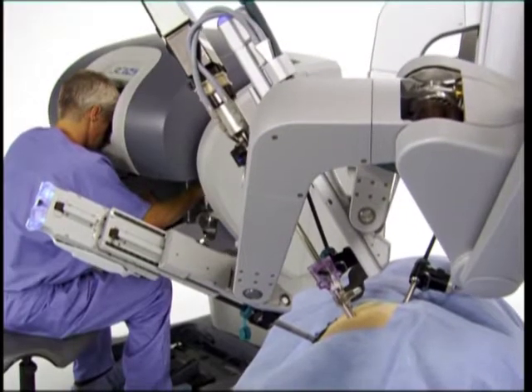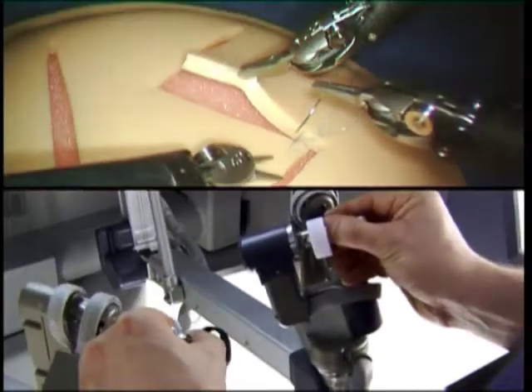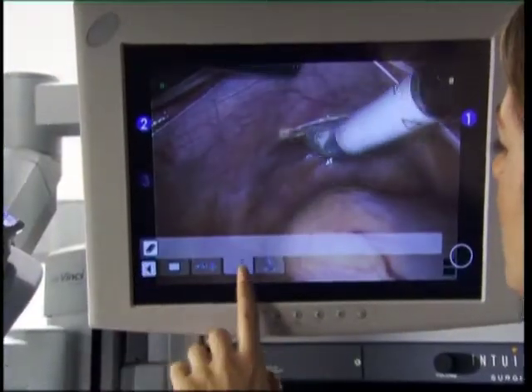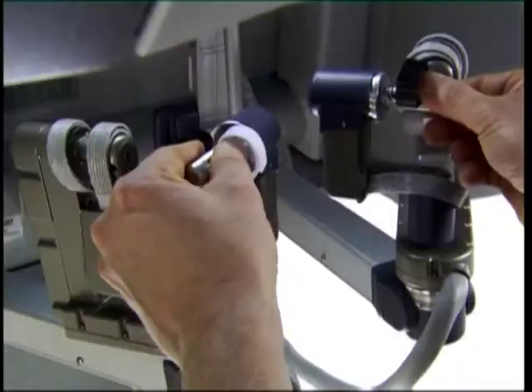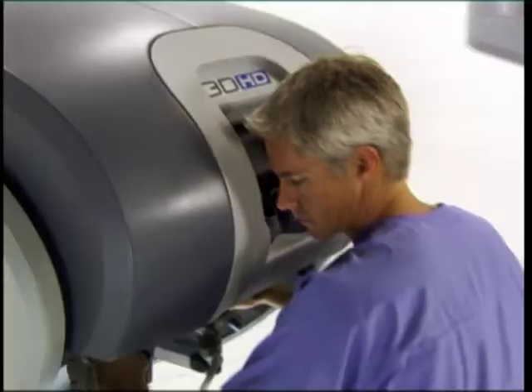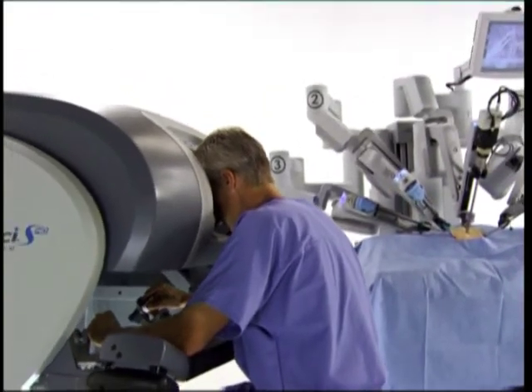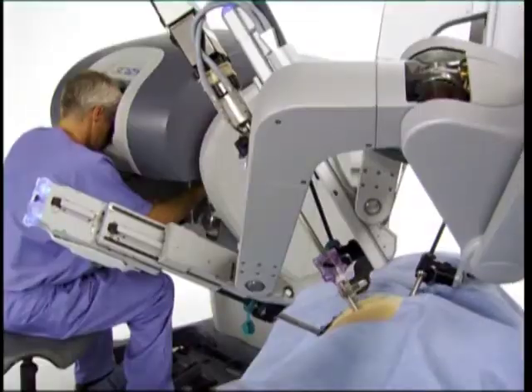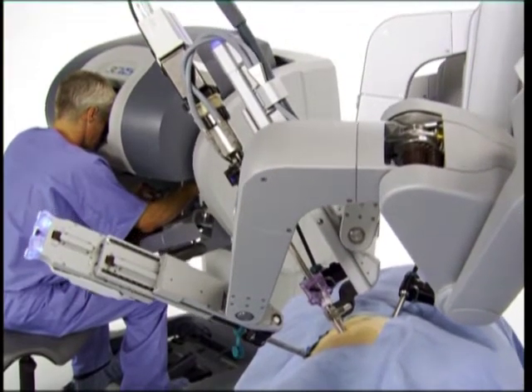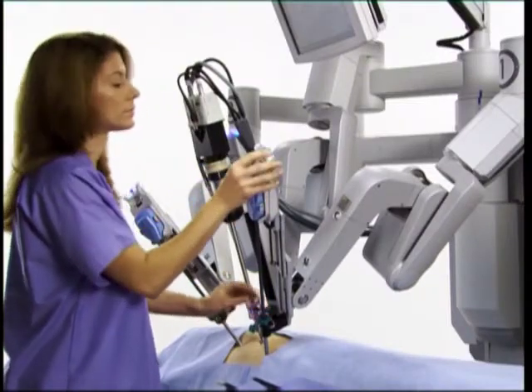The Da Vinci surgical robot is a remote-controlled surgery droid, which can perform the most precise surgical procedures. Using software, its tools and robot arms dampen out tremors or movements that might occur in a human surgeon's hand. Because this machine is remote-controlled, the surgeon can operate from any location. So if the best doctor for a job is in another country, using this robot, they can remotely carry out the procedure. But remote control is just the start of the story.